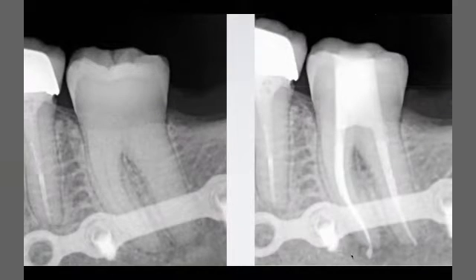Here is the pre-op and the post-op X-ray. You can see clearly that the access was strict to the root canal. I have a straight line access and it was strict and maybe a little bit contracted, because I don't want to open a big access. In calcified teeth you have to be strict to the floor map. You don't need to lose yourself and search in a bigger area. Stay small, but stay in a straight line to the root canal orifice.